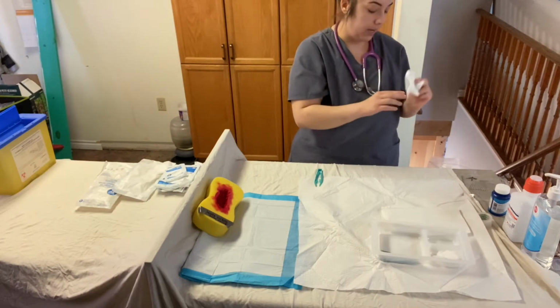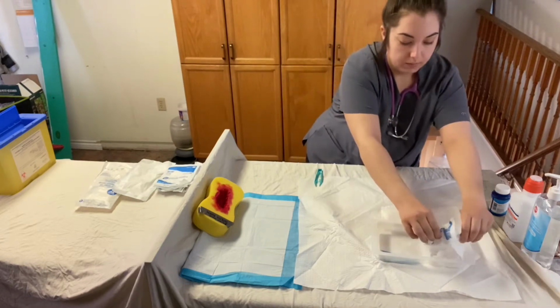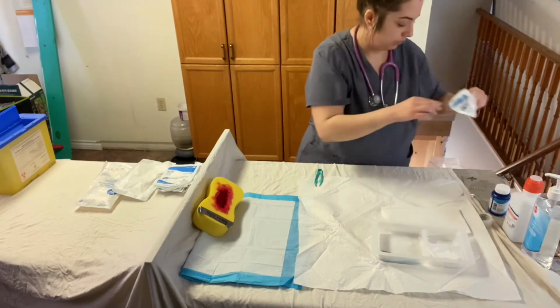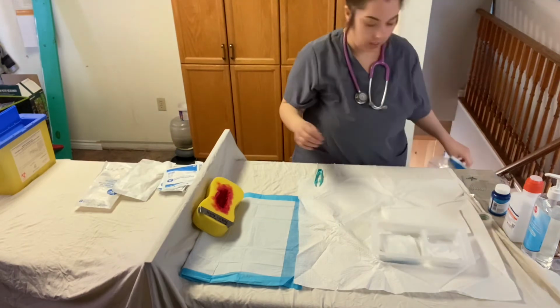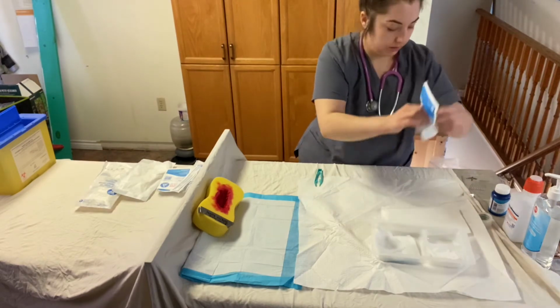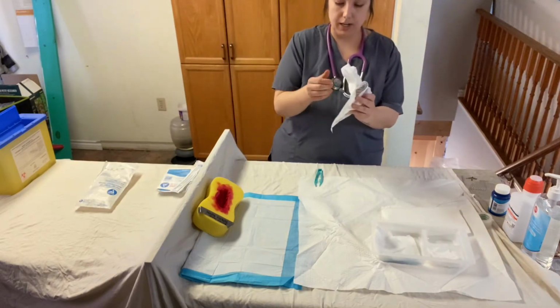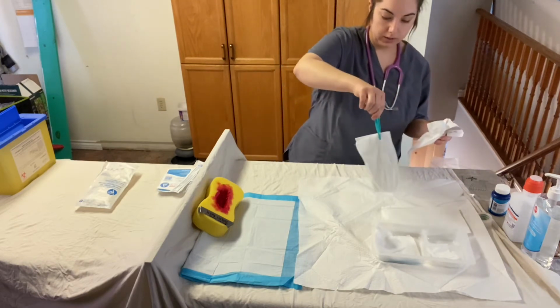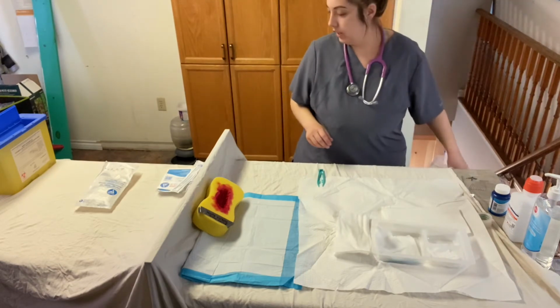I'm only touching the outside of the package, not the woven sponges. Same thing with this 2x2 here, not touching the woven sponges, just the outside of that package. I'm going to do that with a couple of 4x4s as well, with the same sterile procedure. Perfect. And when adding in my abdominal non-woven pad here, I'm only touching the outsides. I'm going to use my sterile forceps to put this in just because the packaging is a bit tight, and I just want to ensure to not break my sterile field. Just place that in the 1-inch border and that in the garbage.